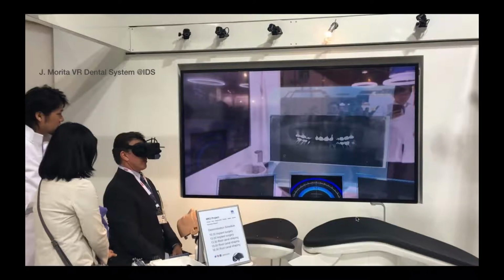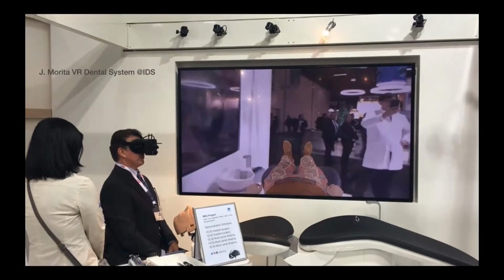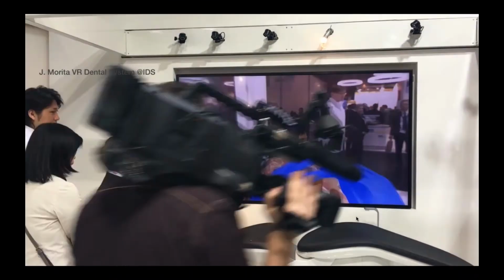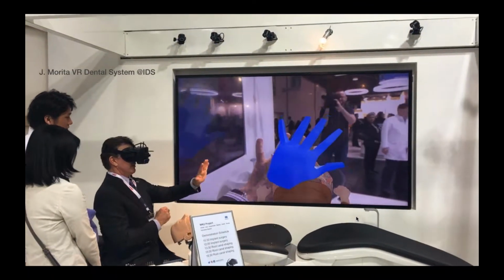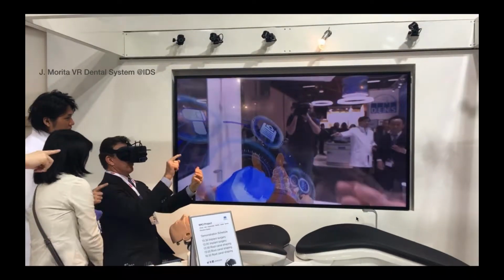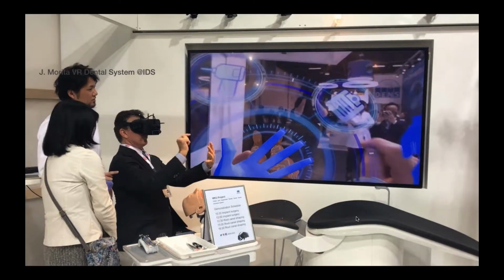Virtual reality, it's a lot of fun, but really nobody wants to practice wearing a bunch of headgear on their face. But let me just show you, this is a little bit Minority Report, the Matrix. There's my virtual patient. She's kind of a creepy, blonde, blue-eyed German gal. And when I put my hand up there, I'm going to choose the functions. And so that is a prototype, so it wasn't that easy to use, but nevertheless, this is the direction we'll be headed in terms of guidance.